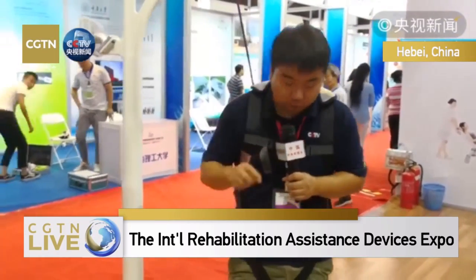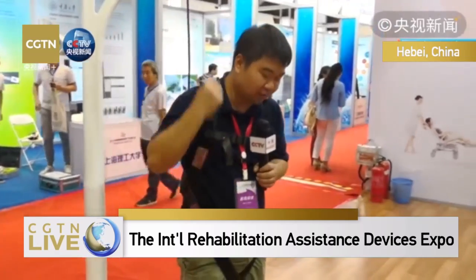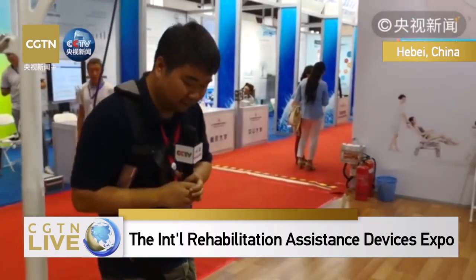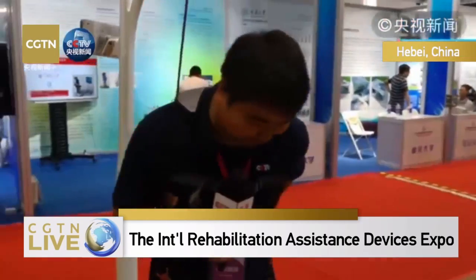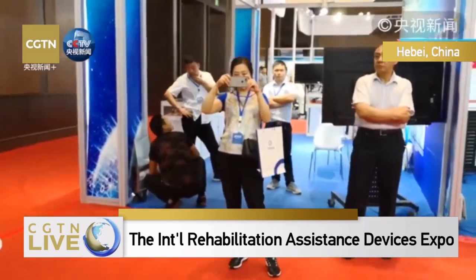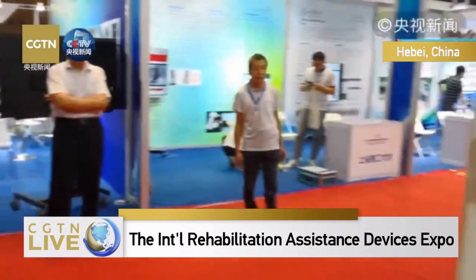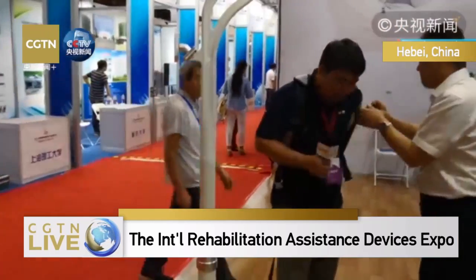The strap here is mainly for protection purposes. When I squat down, I really do feel the power of the straps. And that's it for the experiment.